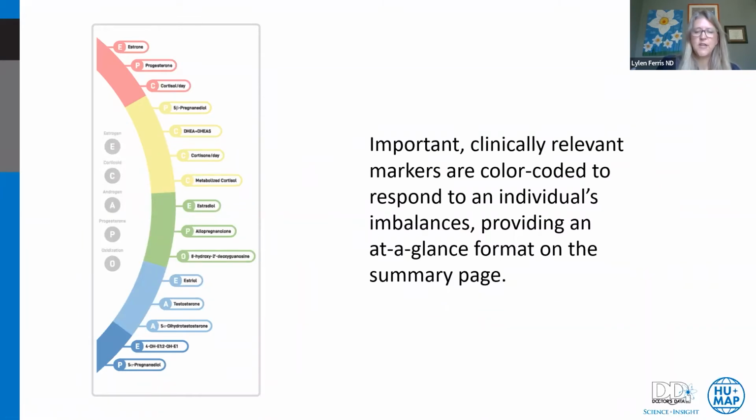The same 15 analytes will populate on each half moon. Some people call this a half moon, some people a rainbow. But the same 15 analytes will always populate here, but the placement will be patient dependent.